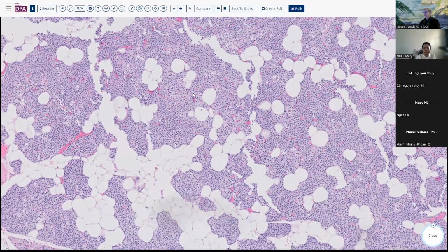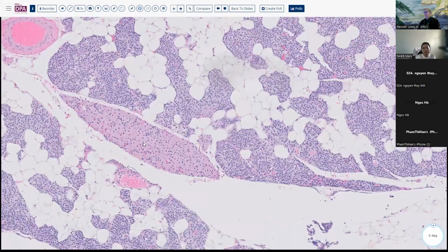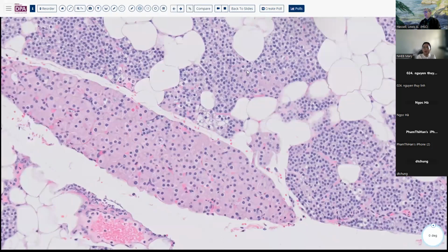the normal. And some of these can exist in varying proportions. Clear cells are dominant. Sometimes the oxyphilic cells are dominant.